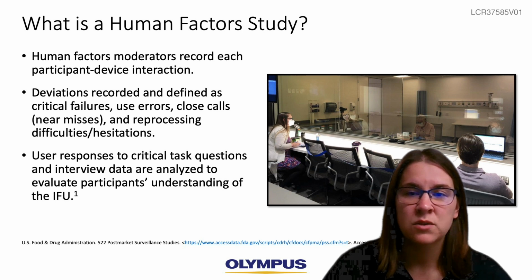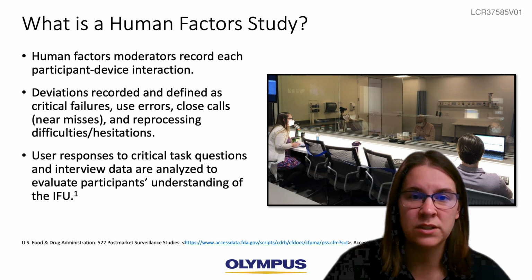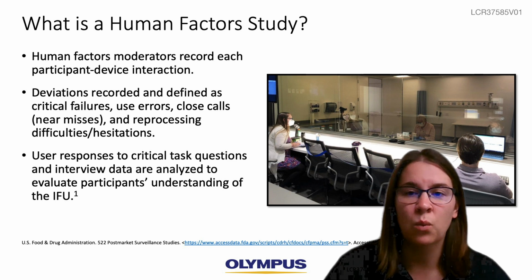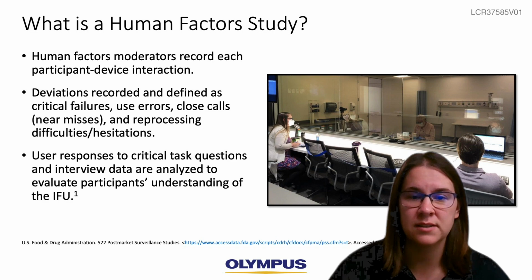Then, the moderators will hold an interview with each participant. They ask them critical task questions where they analyze the participant's understanding of the IFU, such as asking them if they know why they're doing a certain step or what a certain step achieves in the process.